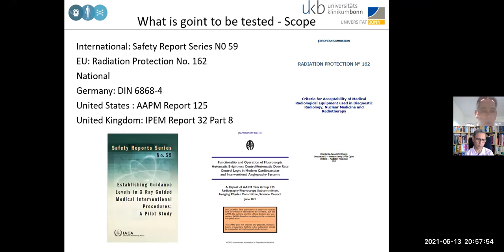For the national ones, you will find in Germany the DIN 6868-4, and in the United States AAPM report 125, and for the United Kingdom the IPEM report 32 part 8. All these reports are not free of charge, unfortunately, except the AAPM report 125. For the other ones you have to pay a fee. But you see, there are quite a bunch of different guidelines which will give you a hand on what's going to be tested and what is useful.